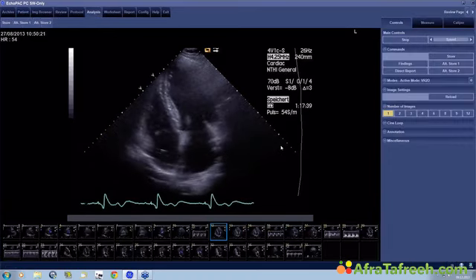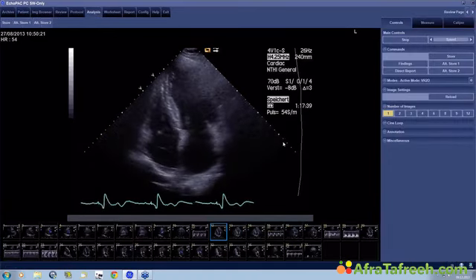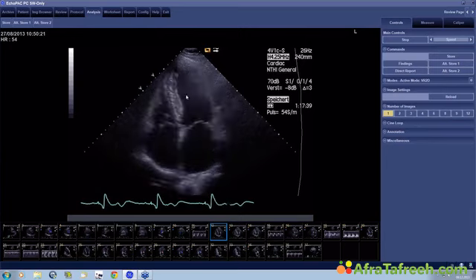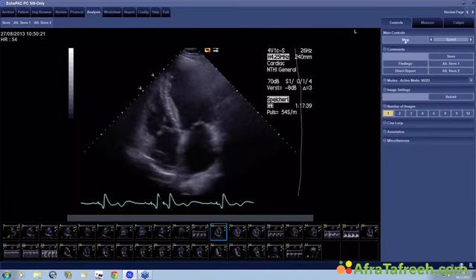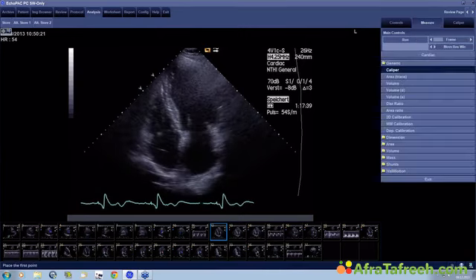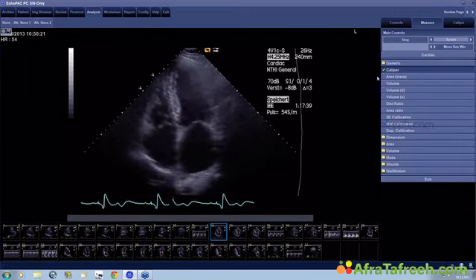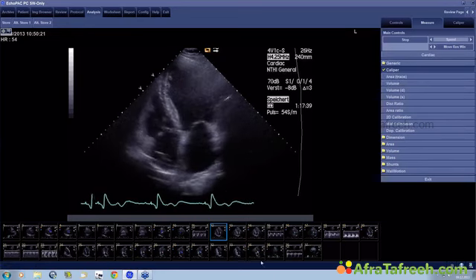Look at this. This is truly the same patient. You know, her function is almost normal. You have a ventricle which has a diameter of maybe 57, so maybe mildly enlarged. And if you take a look at the motion of the heart, you see that it's almost completely synchronous.